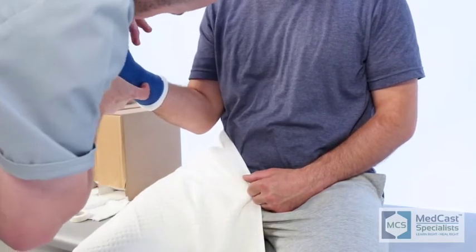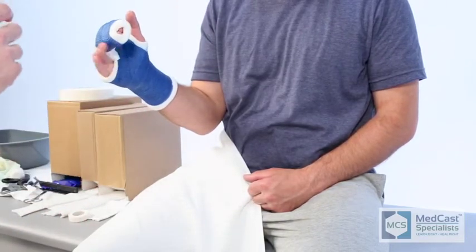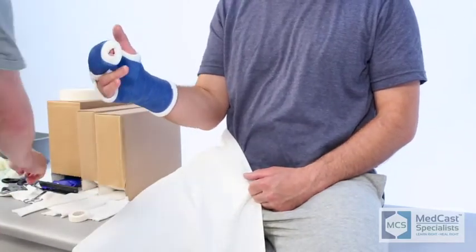You'll notice here that our focus is on the second and third ray, but we have to keep in mind that the fourth and fifth need to be exposed so that they're not getting rubbed on any of the other portions of the cast.